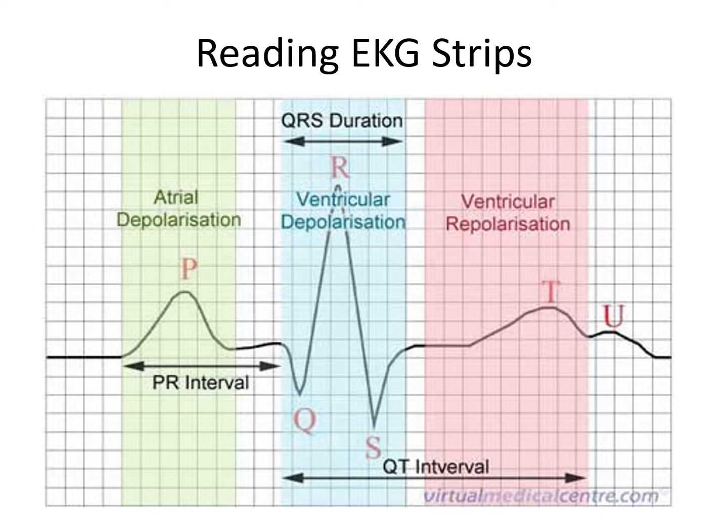I just want to mention one thing while we're looking at this, and that's that it makes a big deal about this U wave here, okay? For our purposes, we are not even going to address the U wave in a basic EKG course. Most of the time, this is not even visible at all. It's kind of hidden under the T wave. So I would probably warn you never to pick the U wave as an answer because it's simply not going to factor into anything that we discuss. So just put that aside there.